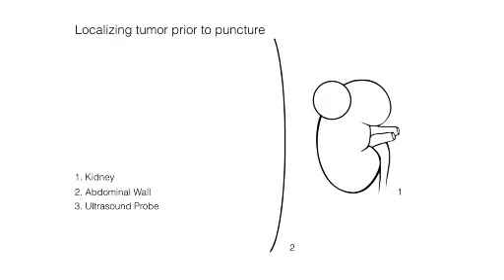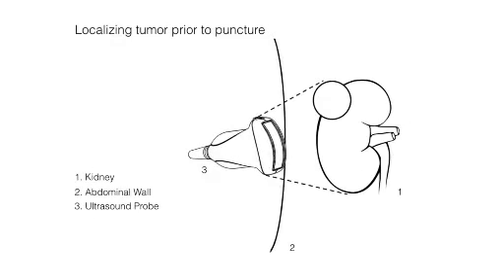This video will start off with a schematic representation of the full procedure, after which we will show you the real video of the procedure that takes place in our interventional radiology rooms. Using ultrasound, localize the tumor and mark the needle entry point on the skin.